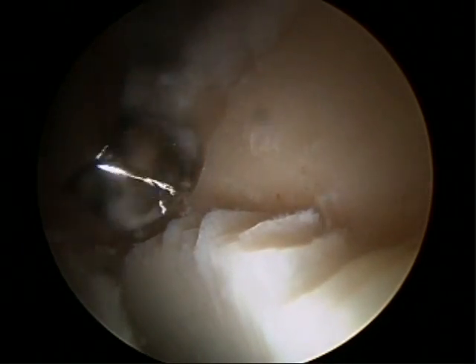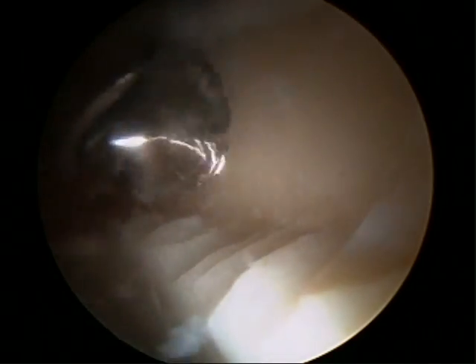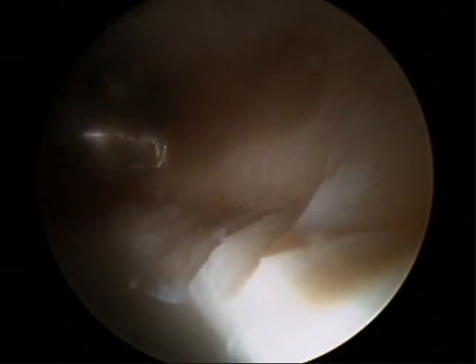Here we'll begin our rim trimming. We do this with extensive fluoroscopic and arthroscopic visualization so that we know we're trimming the correct amount of the rim. This burr is used for this purpose, and we've already decided based on our preoperative radiographs and templating that we're going to trim about five to six millimeters of rim in the antero-superior quadrant. We'll double check as we go with fluoroscopy to ensure we've eliminated the crossover sign and the anterolateral overhanging pincer lesion.